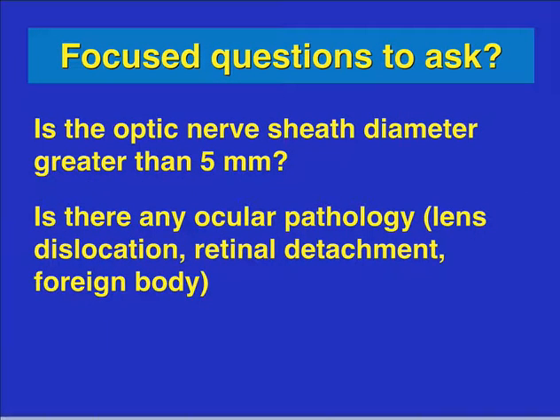Just a few facts. So remember, just like any other bedside exam, we have focused questions that we should ask. Is their optic nerve sheath diameter greater than 5 millimeters? And is there any ocular pathology, lens dislocation, retinal detachment, foreign body?